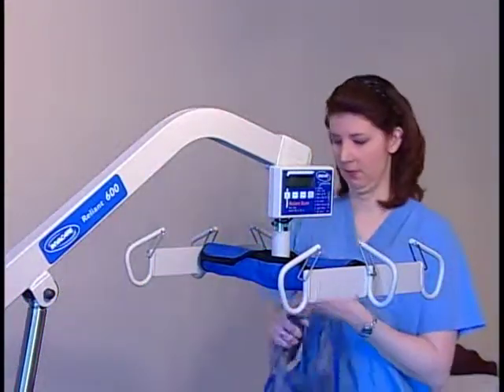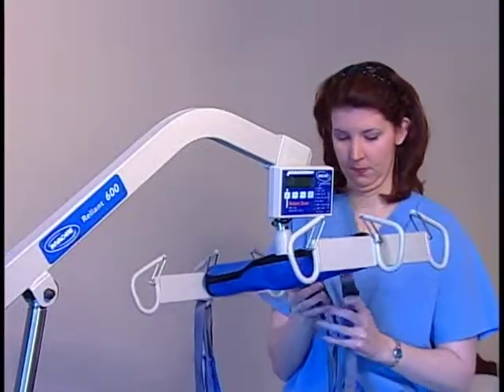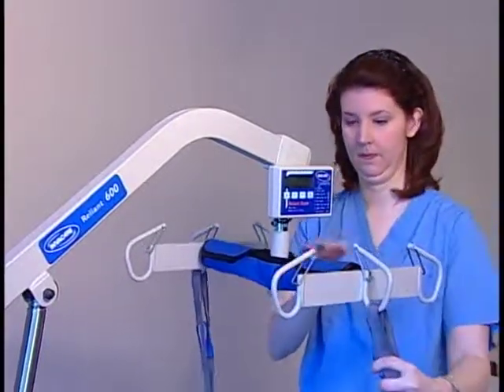Attach the empty sling to the swivel bar. To get the most accurate reading, it's a good idea to attach all sling straps to the center hooks on both sides of the swivel bar.